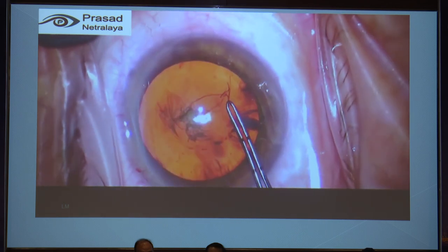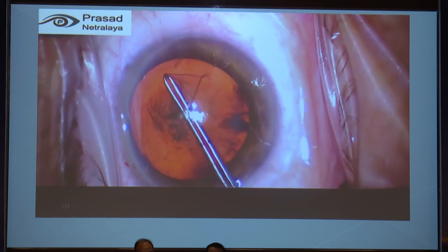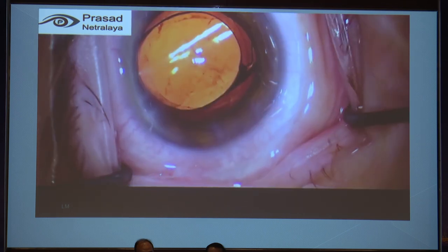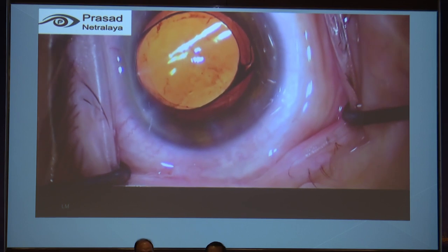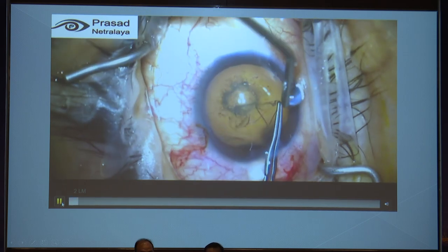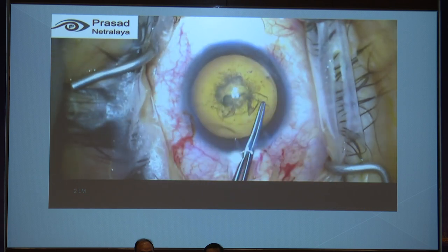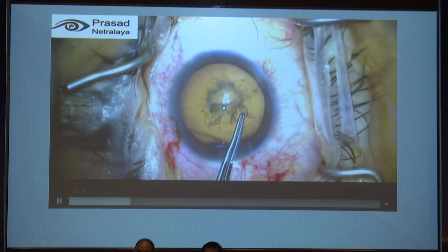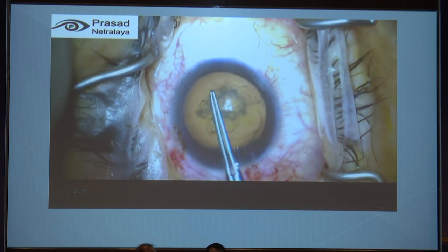Circumferentially, you pull it back so as to initiate a small tear, and once that tear is initiated, go on to complete that rexis. Again, it should not have run off too much in the periphery, but this is more controlled when comparing it to pulling the rexis towards the center. Demonstrating it again, here you have a small runoff that's going to happen. It was pulled back to center.